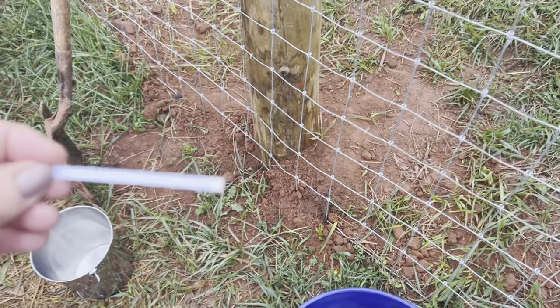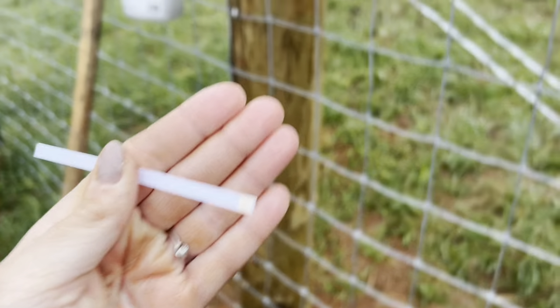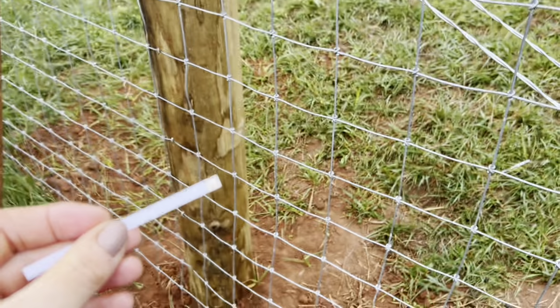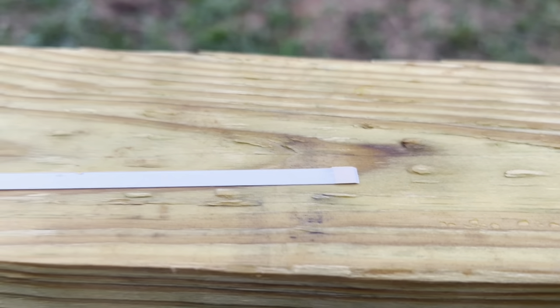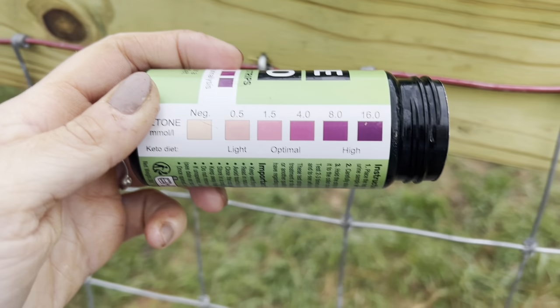I'm going to get a strip — I'm not gonna touch that bottom part. See, you can see my perfect color. I'm just gonna dip this in the pee for two seconds, that's it, just two seconds. Now I'm just gonna set it right here flat and give it a minute. I can already tell it's probably gonna be negative because it hasn't changed color yet — when she's positive it changes pretty quickly.